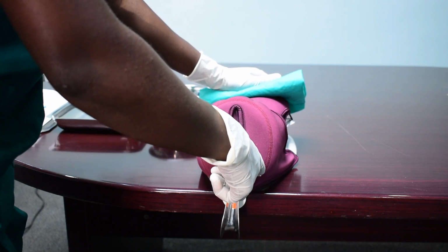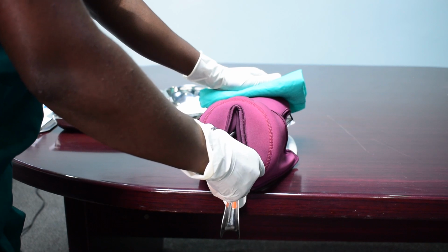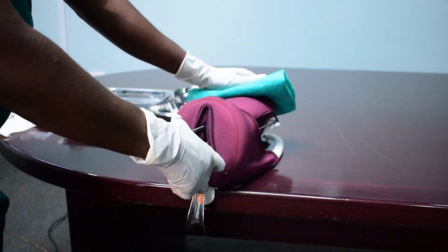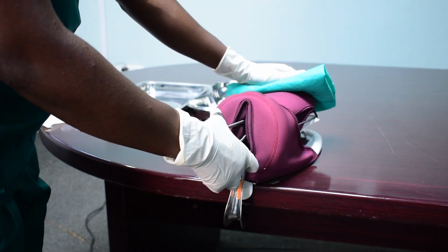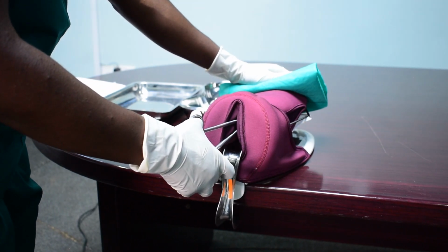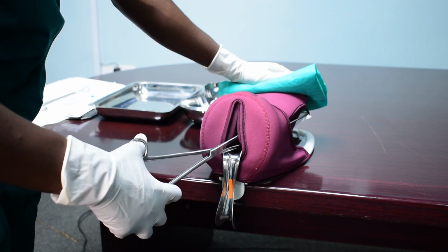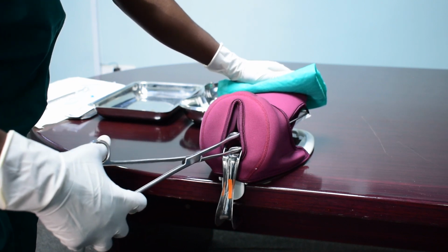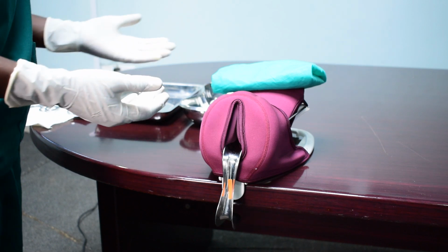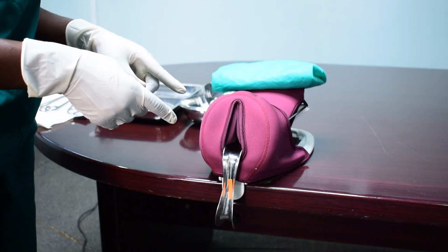Why we are doing this is because we do not want to dislodge the IUD from the right position where we've put it. And then while keeping the Kelly forceps slightly open, we will now remove it gently while moving along the side of the uterus so that we do not grasp the IUD and come with it. So we shall gently remove our Kelly forceps and set it aside. So you can notice that I kept stabilizing the uterus until I removed the Kelly forceps.